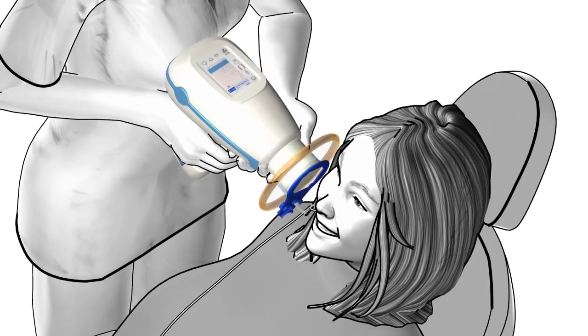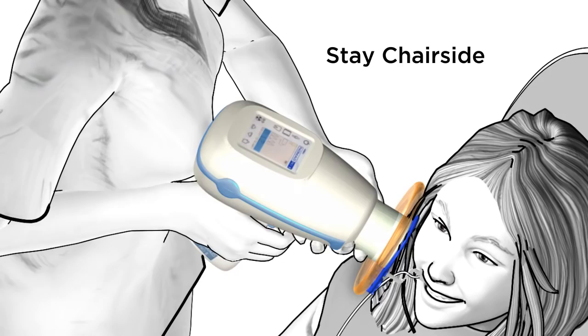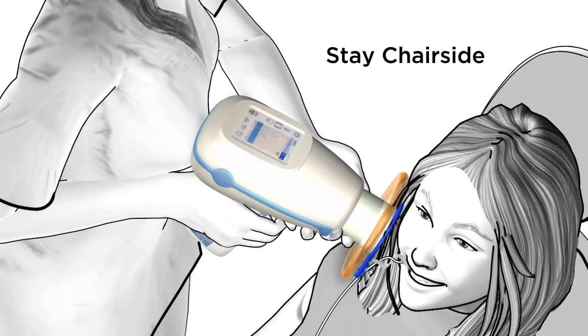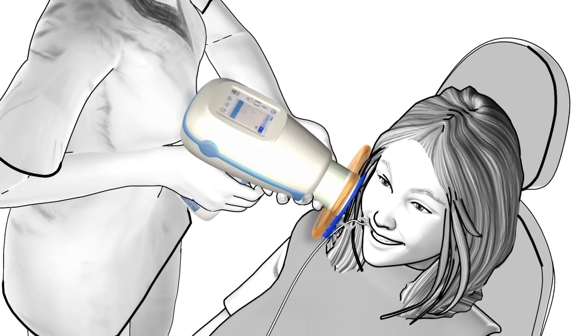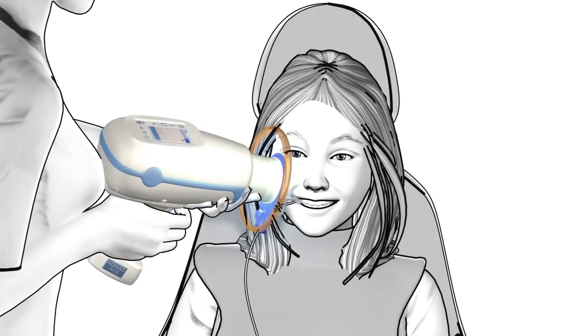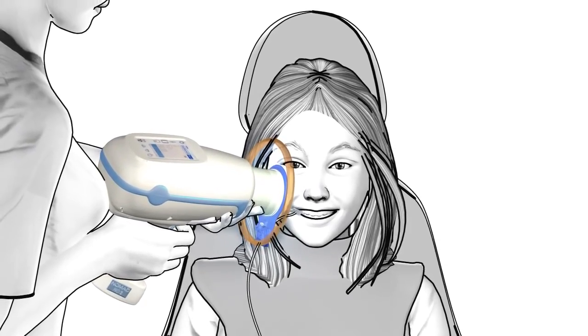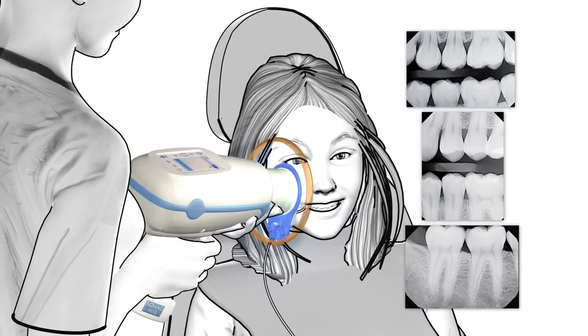Using Nomad Pro 2 is simple and safe for you and your patients. A trained operator can take x-rays while staying with your patients with the easy-to-follow safety instructions for both the operator and the patient. Feel confident and know you are taking great images while making the overall experience faster and more comfortable for you and your patients.